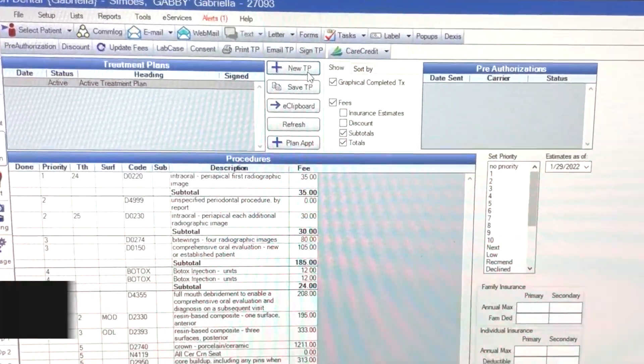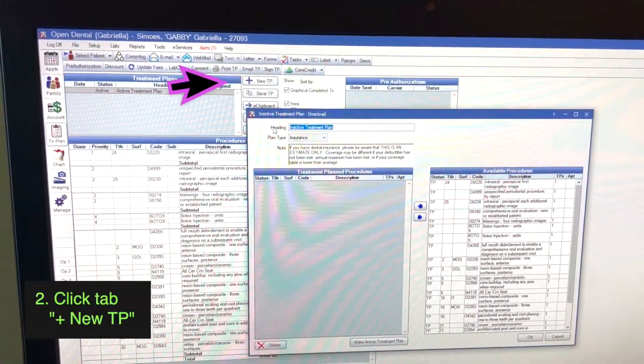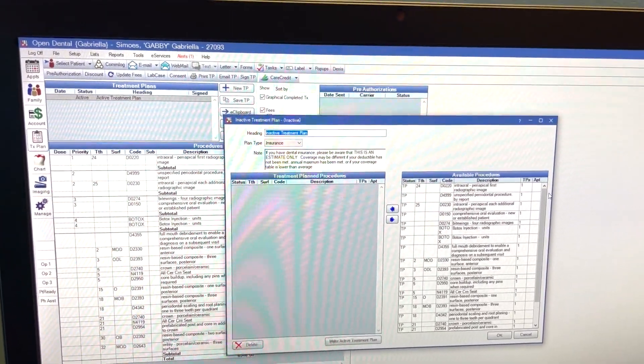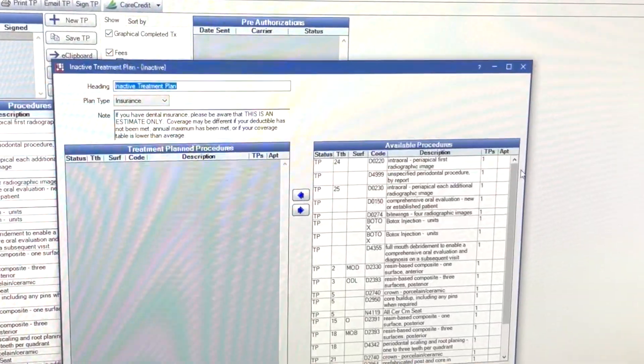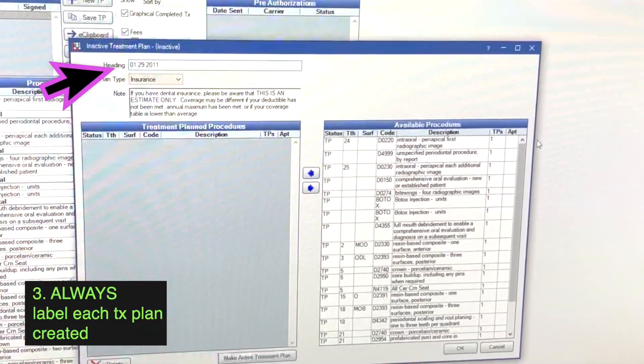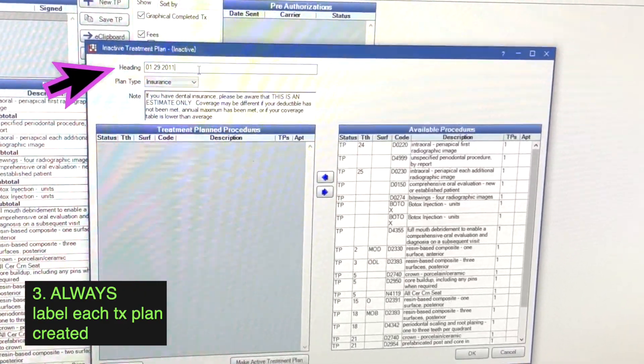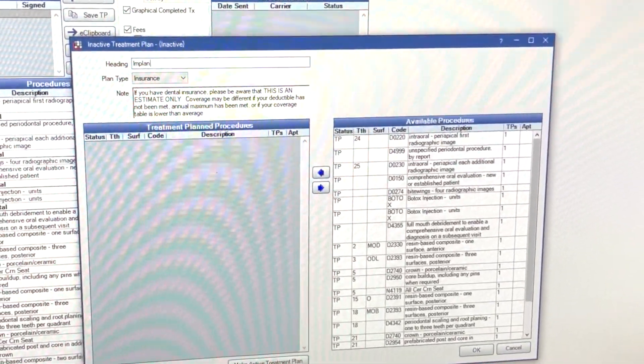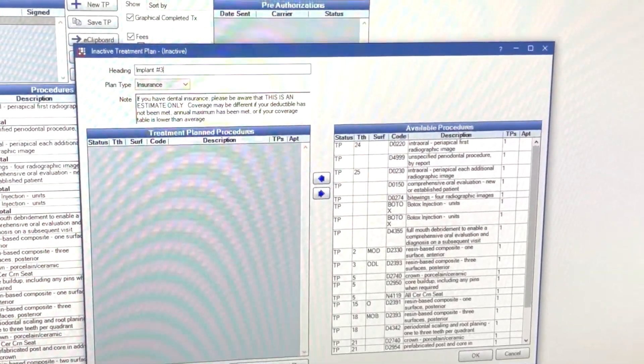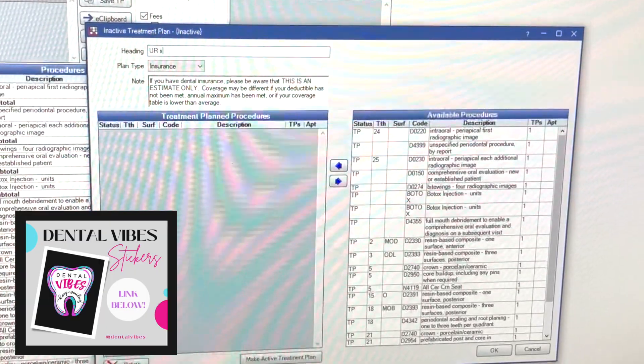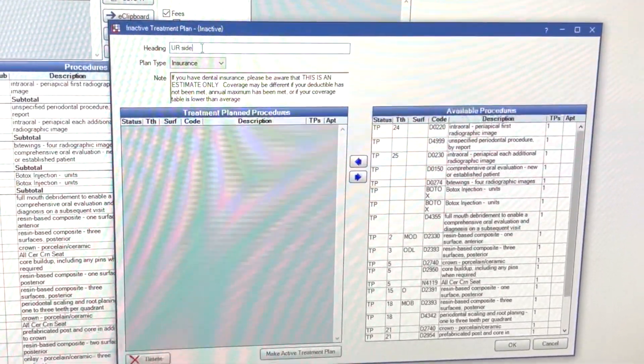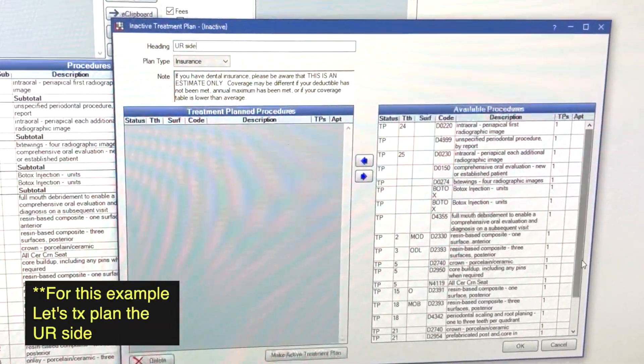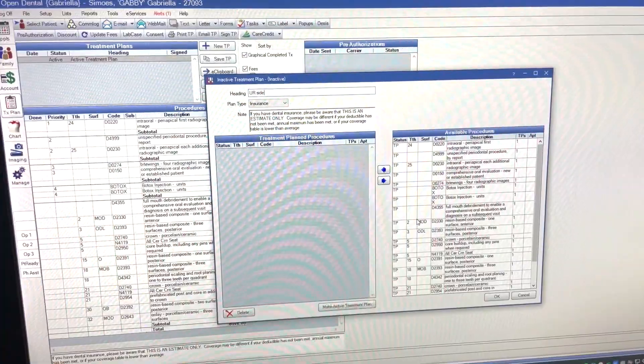So we're going to create a new one because we're going to phase it out our way and maybe we're going to skip some of it that's not going to get done immediately. We're going to put today's date. Or you can also put like upper right, upper left, or you can do if you're talking about, say, implant number three, or upper right side, however you want to label that heading. Let's focus on that upper right side.